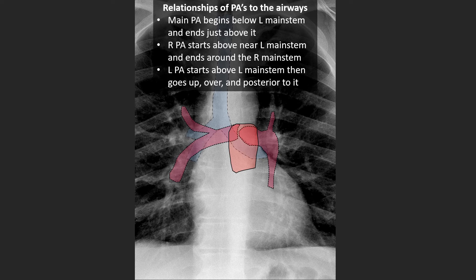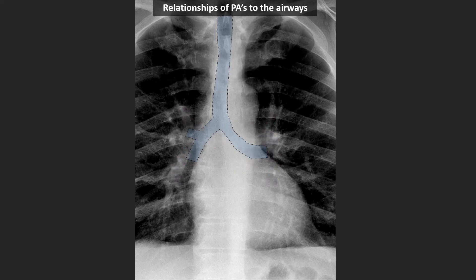Here are these structures superimposed on each other so you can see the anatomical relationships to the trachea and main stem airways. Here again are the target areas that we want to look for catheter position.